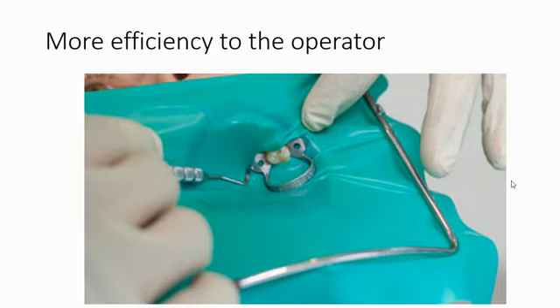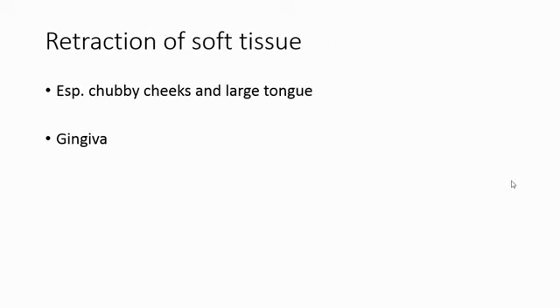So your efficiency of doing the procedure both ways, the success, longevity, everything, and the ease of doing will be improved a lot. Retraction of the soft tissue. As I told, tongue and the chubby cheeks.